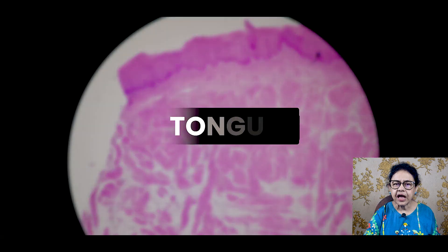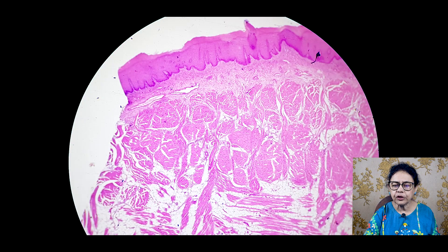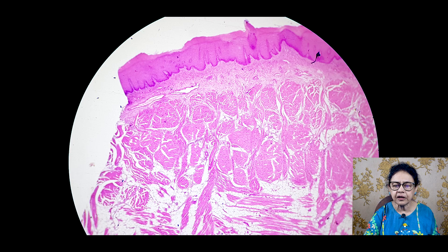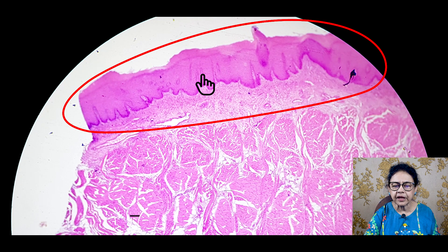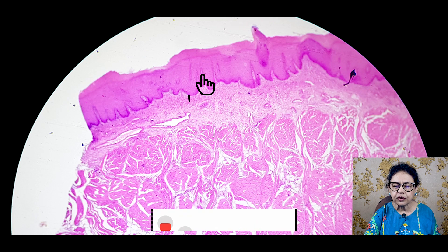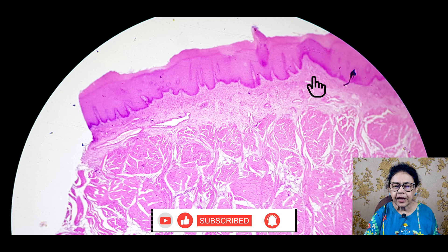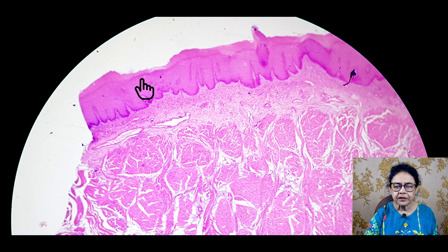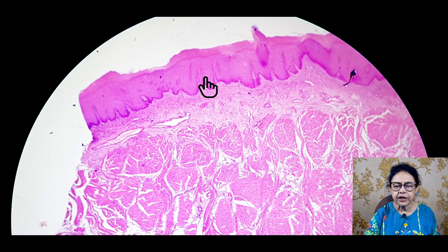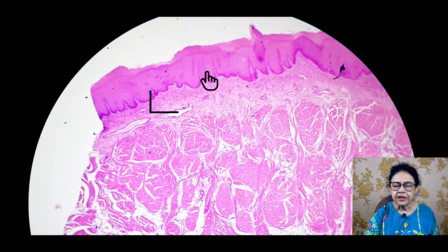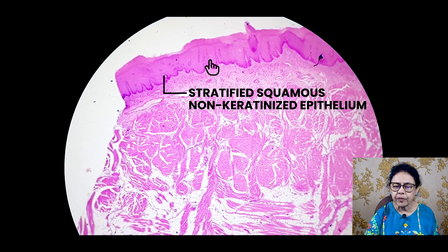This is the slide of tongue. How will you identify the slide of tongue? You will see our tongue is also very much rough than the other parts. So the mucous membrane of the tongue is so thick, like the border of a shari. You see, this whole thing is the epithelium. So what type of epithelium is it? It is stratified squamous non-keratinized epithelium.